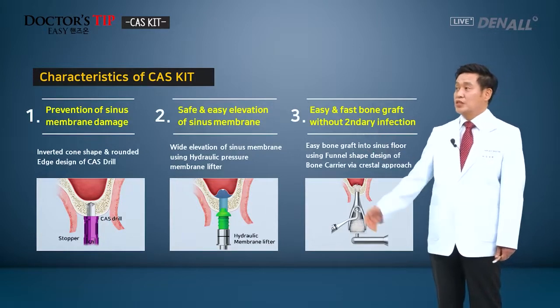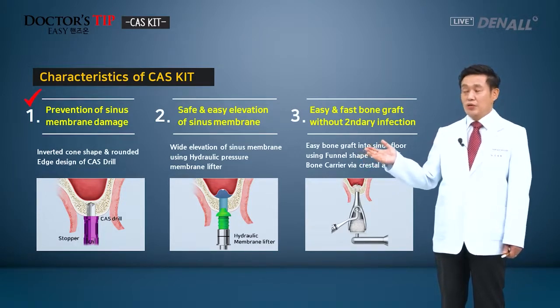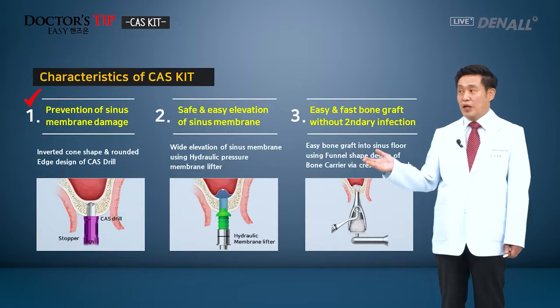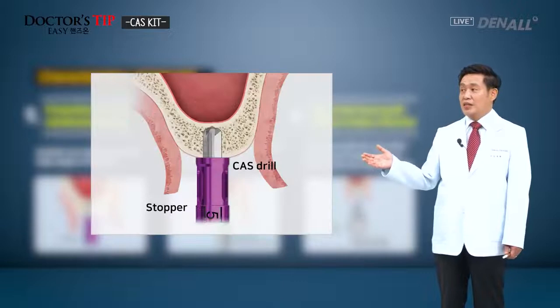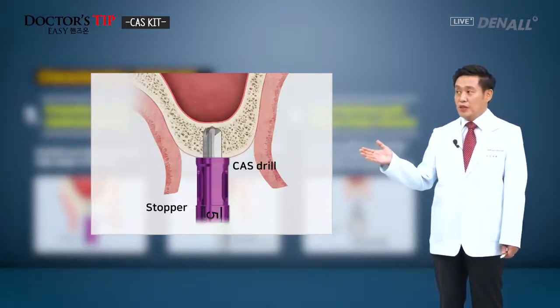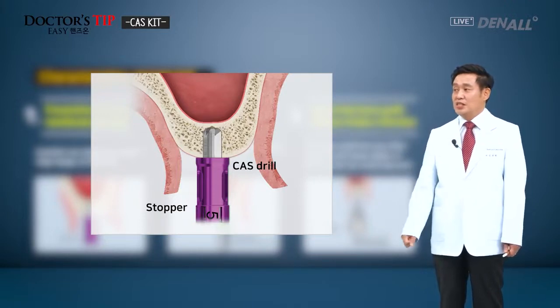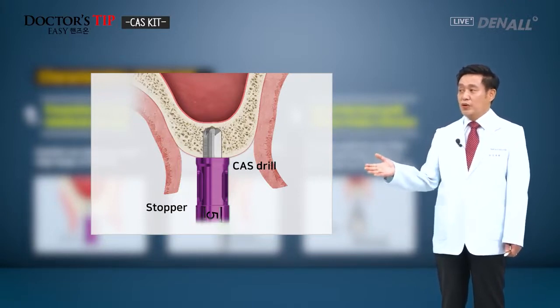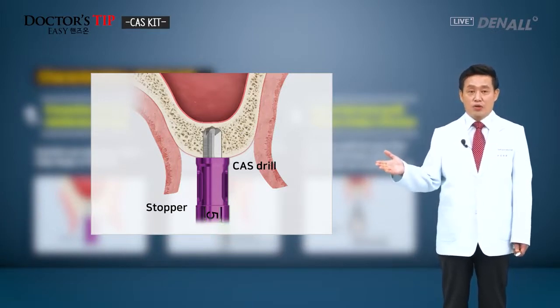Let's look at the characteristics of the CAS kit. First, the CAS drill itself: the top of the drill has an inverted cone shape and the edge is rounded. So when you use the CAS drill, it minimizes damage or perforation. You can penetrate into the sinus floor. There's a stopper so that you can drill to the depth that you want.